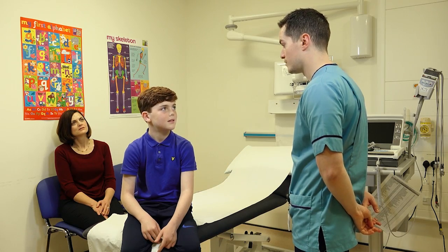Why would anyone need this? Well, the doctors like to know what your heart rate and rhythm is like, not only in the hospital but when you're out and about as well.